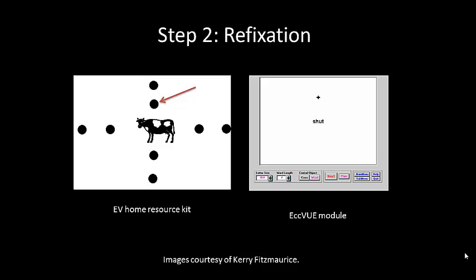Now, this module is showing a 4-letter word. However, if you're starting out, you should just introduce single letters or shapes or numbers perhaps, rather than something as complex as this kind of 4-letter word. It's a little bit too hard in the early stages of training.